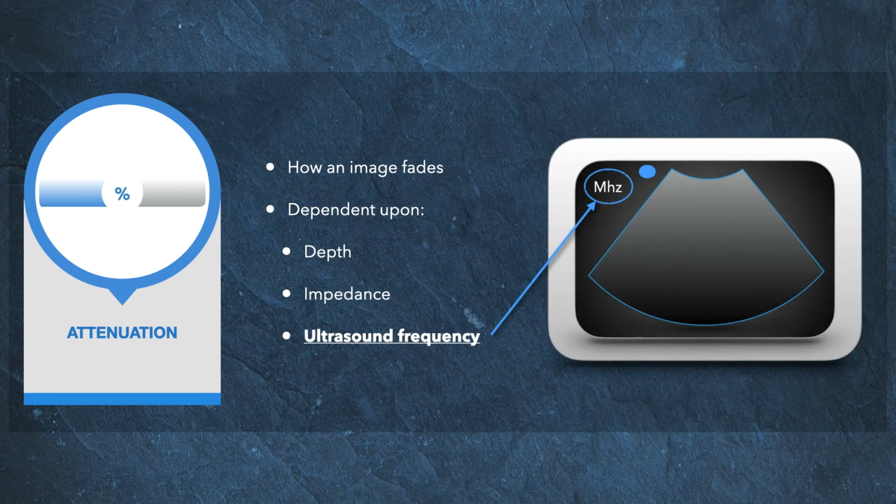As mentioned previously, each ultrasound probe or transducer has its own intrinsic frequency, and each one has a range which is predetermined by the manufacturer. In general, the lower the frequency, the more deeply the sound wave will travel into the patient's body. At the same time, you will sacrifice some detail in the image due to absorption, reflection, refraction, as mentioned previously. In general, the higher the frequency of your transducer, the waves will not be able to travel as deeply into the tissue, but you will have tremendous detail, and you may be limited by the depth of that transducer.